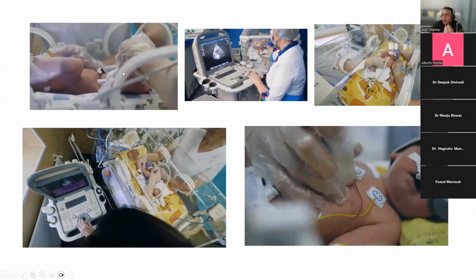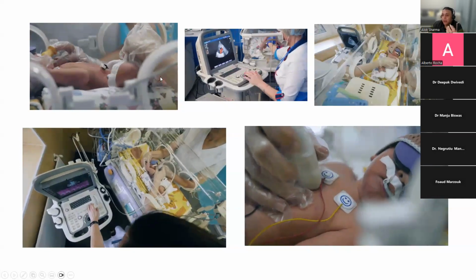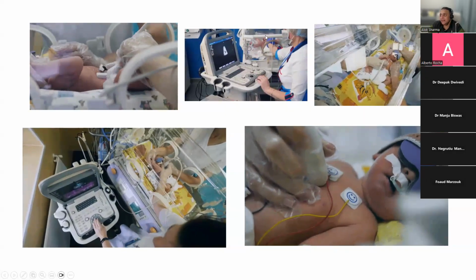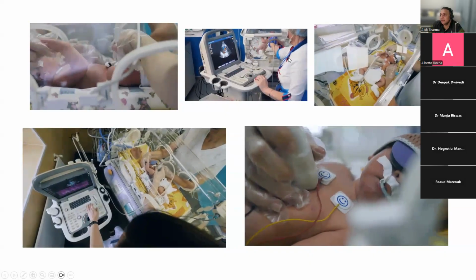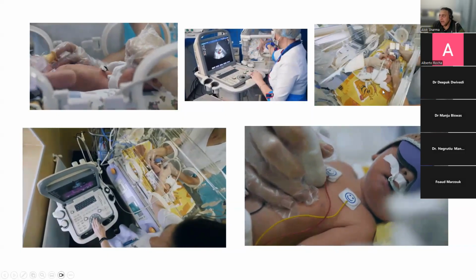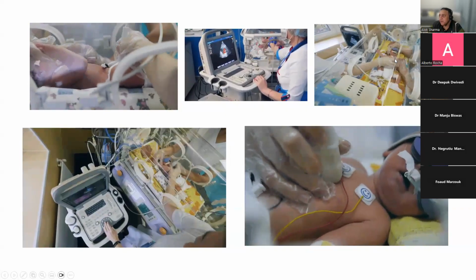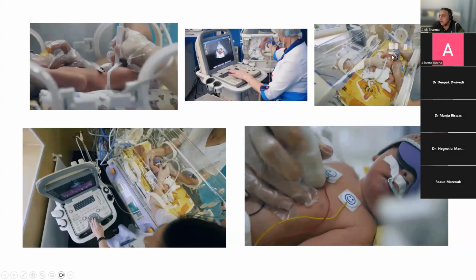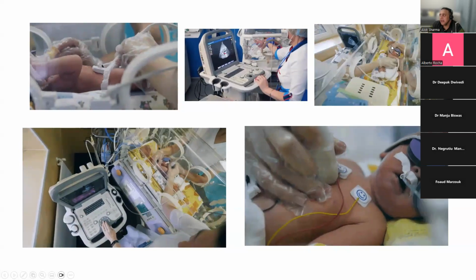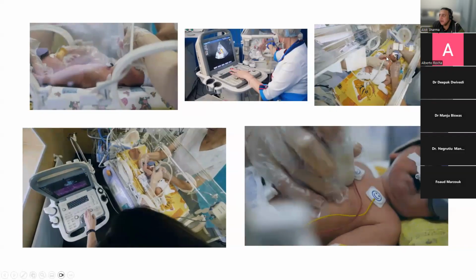Having good ultrasounds is just about contact. It's not about pressure. A real tendency that we have is to push the probe when we're doing our protocol for ultrasound. And again, this is a single person doing an ultrasound in the middle over here. Good luck. She's doing a great job, but it's really tough. Swaddling over here is not being done properly, but you can see that once the baby has been soothed, by giving him something to suck on, you can see how his hand is being contained towards the end of the video, with the nurse using her fingers.